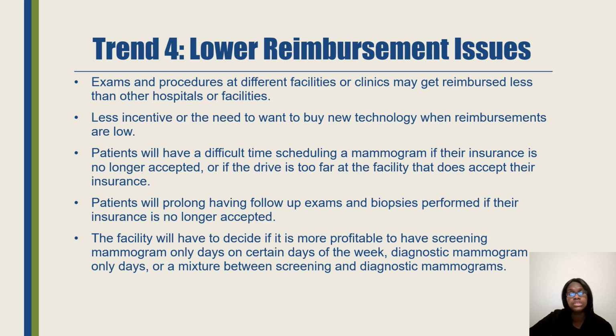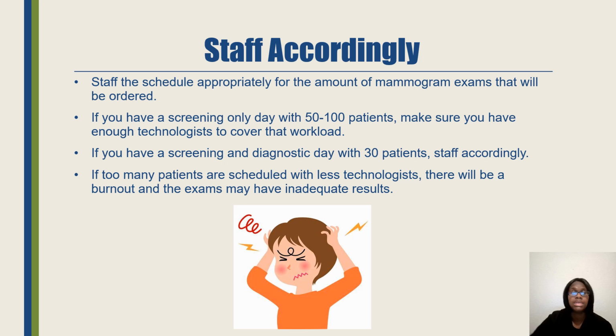Lower reimbursement issues, especially if facilities aren't using AI as much. Make sure that you are staffing accordingly, because if a technologist is short staffed, they probably would not perform as well. You're going to have AI flagging more mammogram images because if a technologist is burnt out, then they're not performing at their highest capabilities. They're tired, we're burnt out. So that may be the day AI flags a lot of images for improper positioning, patient motion, and technical repeats.